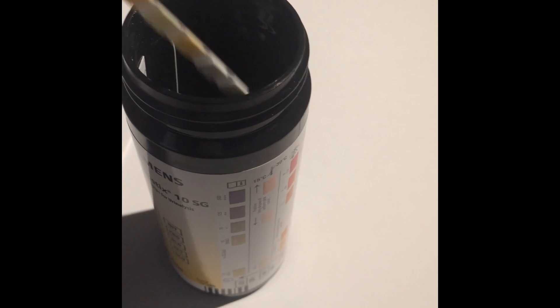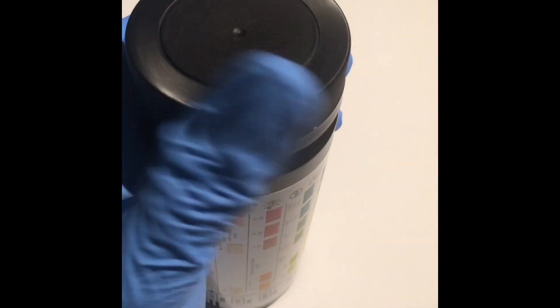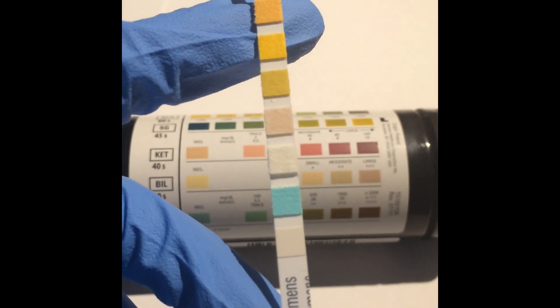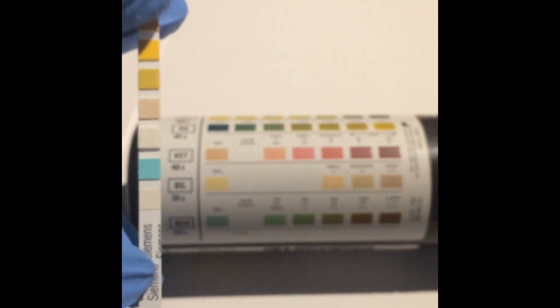Here is the dipstick. I'll go through with you how to interpret the results first. The first white square is simply a color comparison.